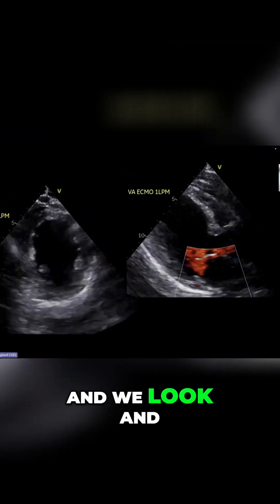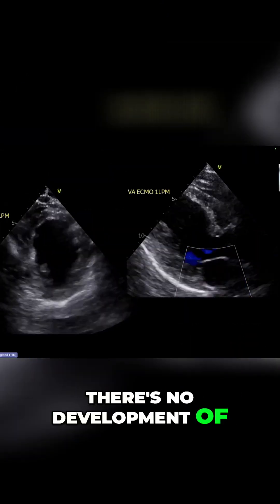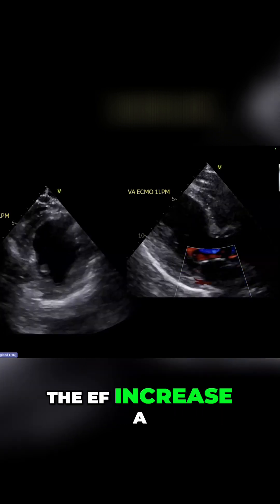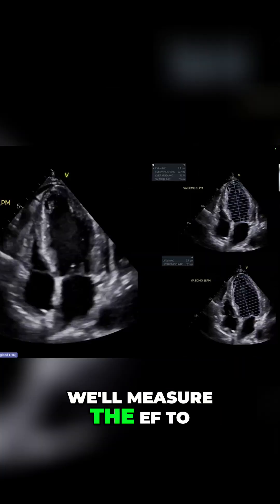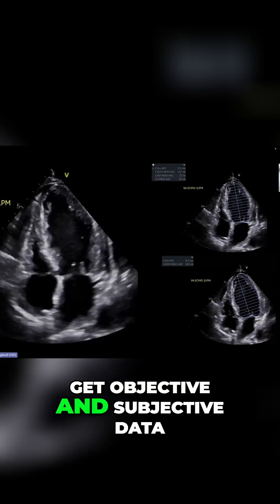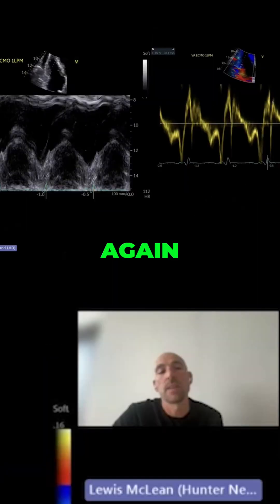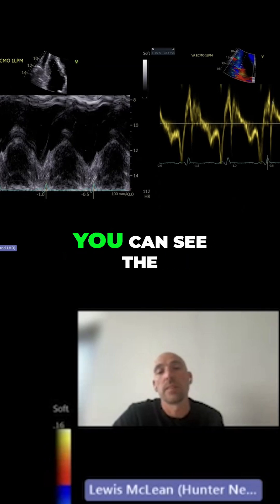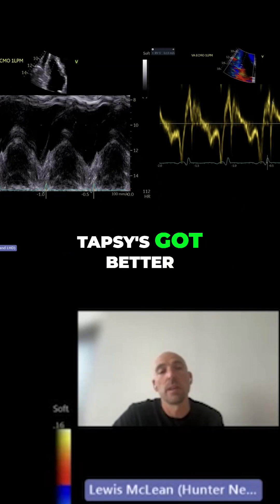We look and we see that there's no development of mitral regurgitation. We want to see the EF increase a little bit — we'll measure the EF to get both objective and subjective data. We also make sure the right heart is improving; you can see the S prime is improving and TAPSE has got better.